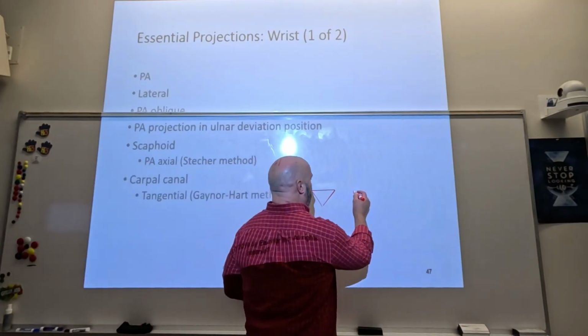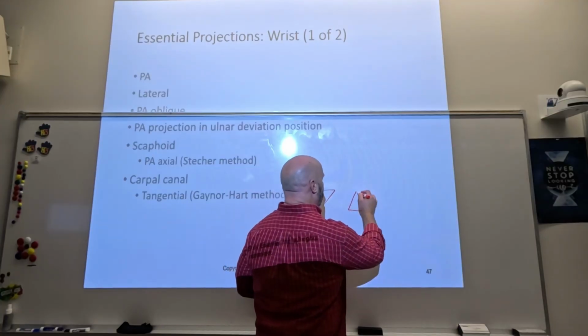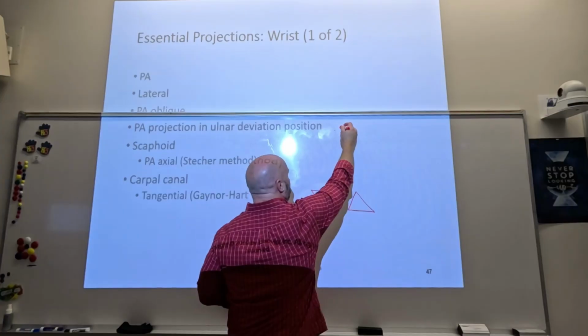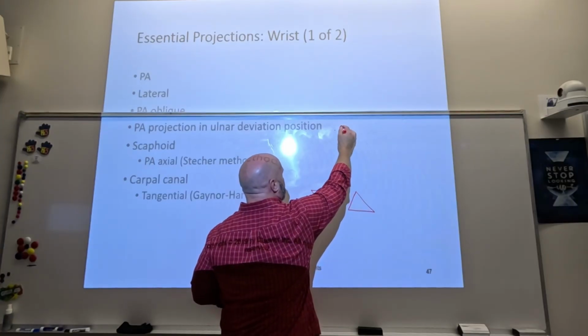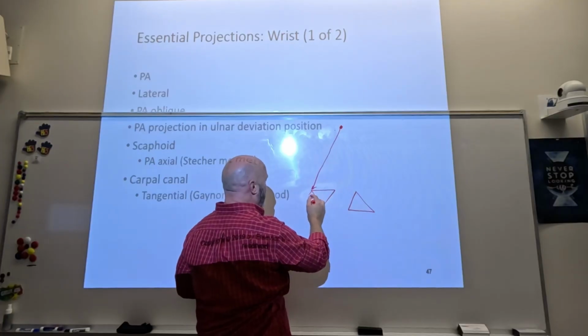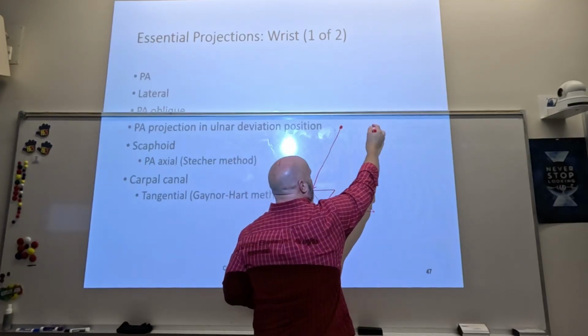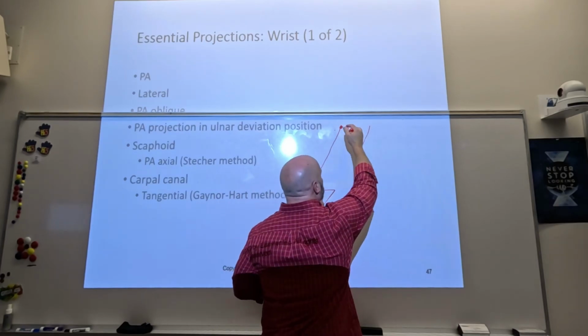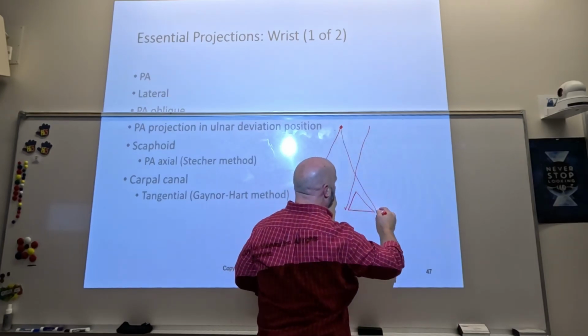Now, let's say we've got two pieces of anatomy side by side. And we got our X-ray beam coming from this small source. Which one is probably going to show more magnification and more loss of sharpness or recorded detail? Well, we even come from the same spot.